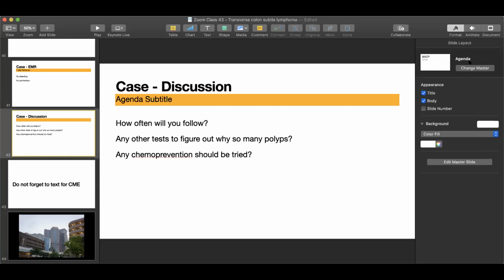The universal colonoscope became available in this country within the last maybe 12 or 16 months. It's relatively recent. And what is it called? I'll text you. In this patient with a right hemicolectomy, you can probably get away with using a therapeutic gastroscope. With a therapeutic gastroscope you have the high definition capability, but you do not have the near focus capability, and then you may feel, oh no, is my diagnosis correct or not?